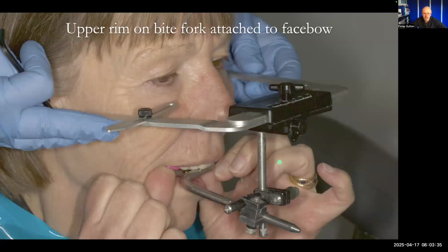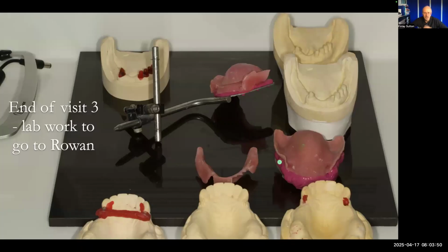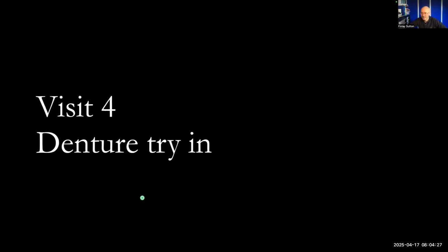Also, what I do at that bite registration visit, on the carved upper rim, I do a bite fork. And then that means that we can mount the upper working cast using that face bow. So this is what all goes back to the technician. This goes back to Rowan. If I just point things out, we've got the working cast lower there with the replicas. That's the working cast upper with the metal rods. So this and that will be mounted. So this wax rim here will mount the upper cast first onto the articulator, and then this here, which is the central bearing apparatus, will mount the lower to the mounted upper. And then Rowan can do a denture try-in too.